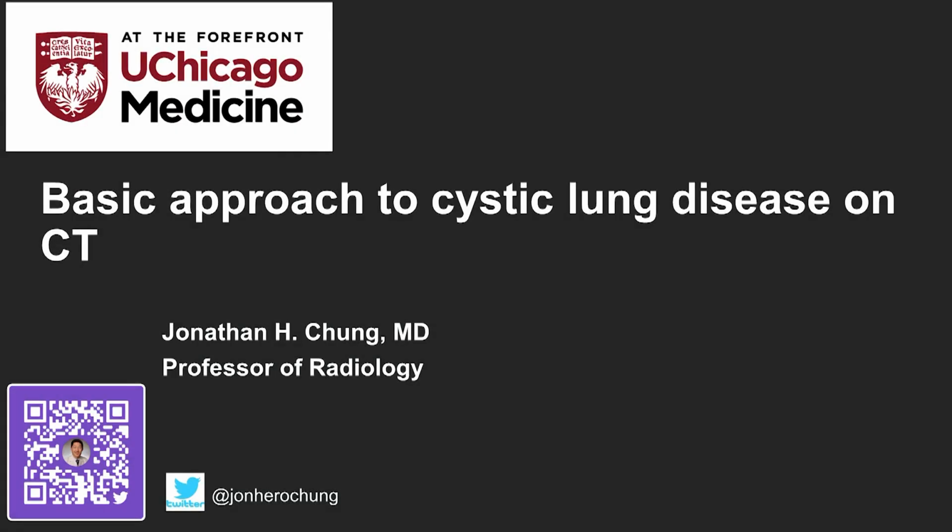All right, so this is actually one of my favorite topics. Not because it's so esoteric, but because I think there's actually a framework where we as radiologists can be quite accurate in this disease setting.